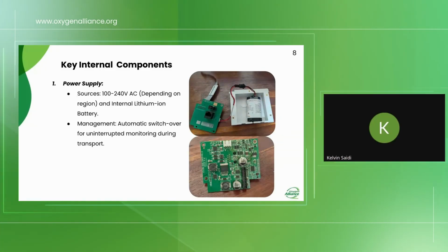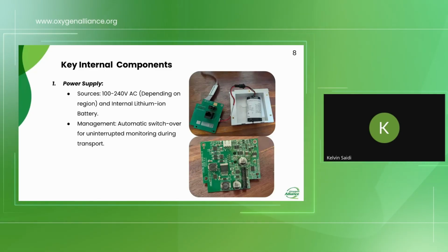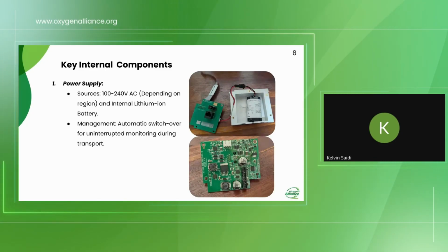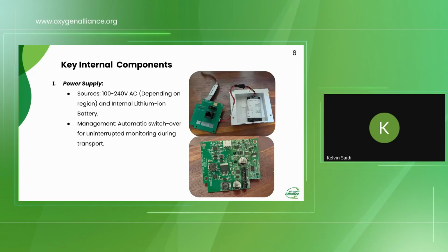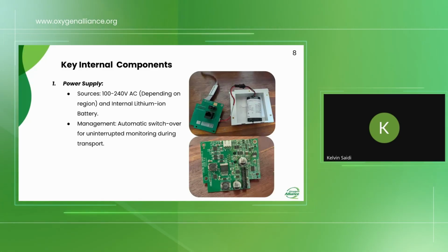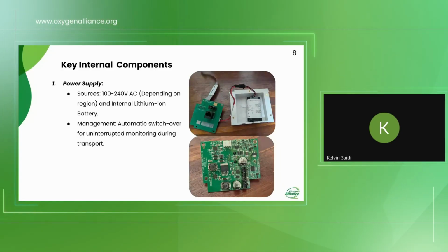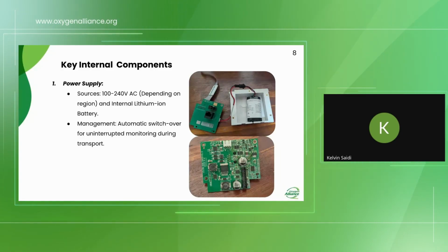So as I was saying, this is how some power supply modules look like. So you have the battery and the main board that receives the main supply and processes it, steps it down, and then sends it to other boards on the device.